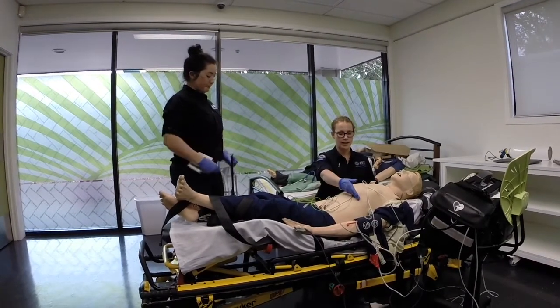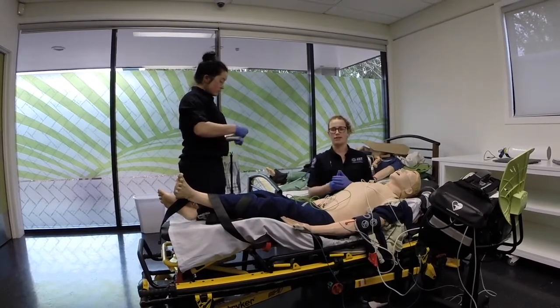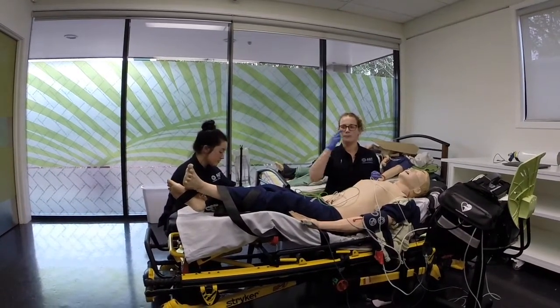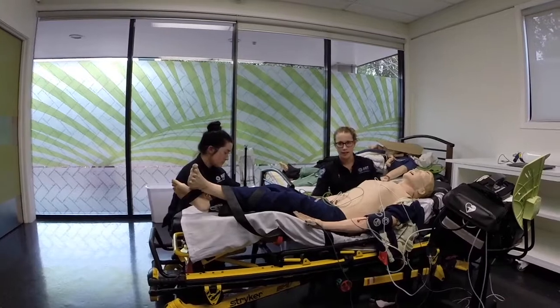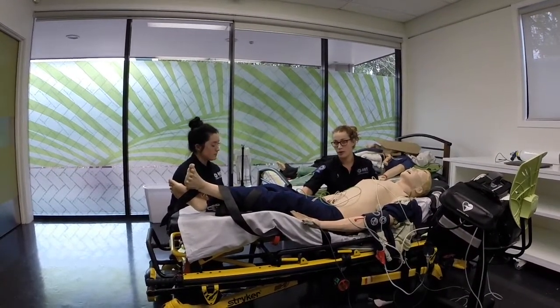Crackles will still be there, however we can revert that en route to hospital. We'll also start driving towards our backup. His circulation, his colour is coming back. I've got a radial pulse now, and he is no longer short of breath.